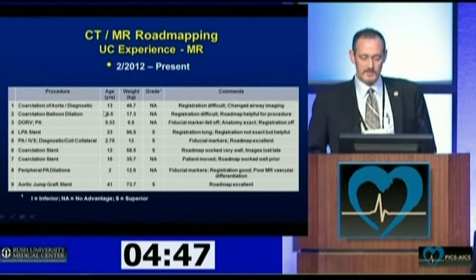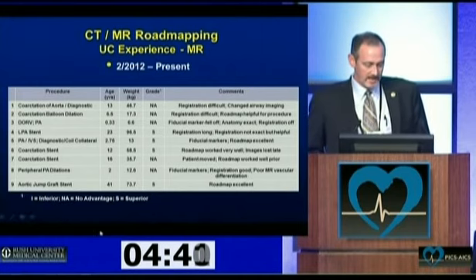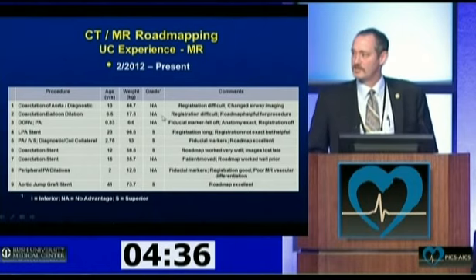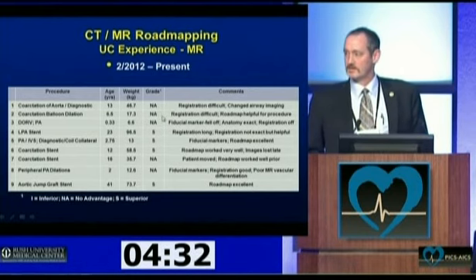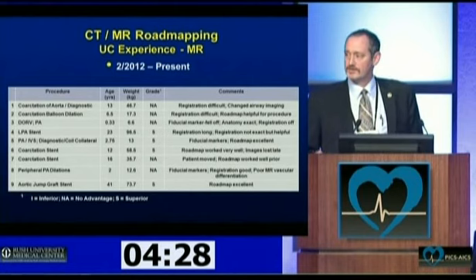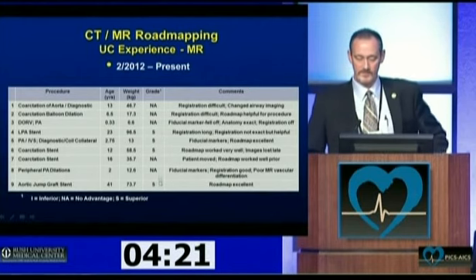As you can tell, we rated each case as either inferior, no advantage to fixed plane angiography, or superior. There is a learning curve to using the process, and it took us a little while in the beginning to get used to it. The main reason for the no advantage ratings in our first couple of patients was the time involved in registering the images. But as we got more facile, the registration process became much easier.